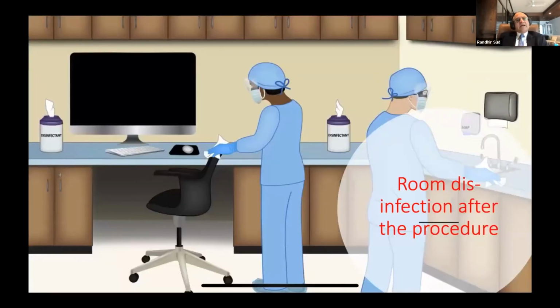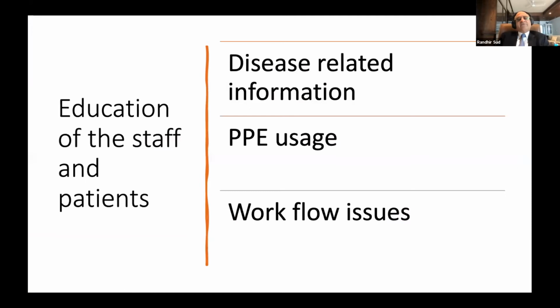The most important thing is that after the endoscopy, you will need to have an enhanced infection control protocol of cleaning the endoscopy area after each procedure, which will definitely reduce your throughput, but it is very essential when we are in the pandemic or early recovery phase. Education of the staff, according to me, is disease-related information, the proper PPE usage, both donning and doffing of the PPE and its appropriate use, and workflow issues should be discussed with the staff, and they should be educated about it so that we can get maximum cooperation.